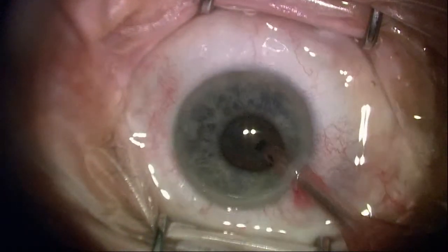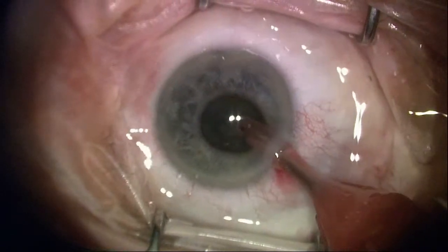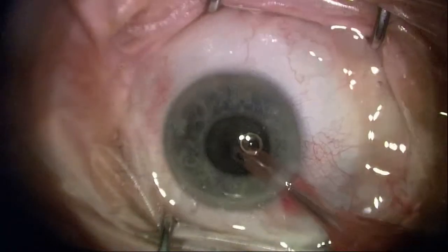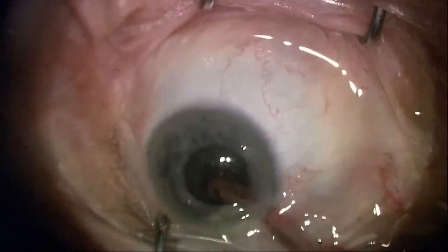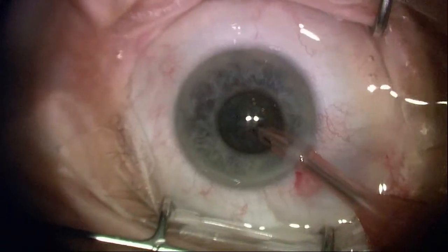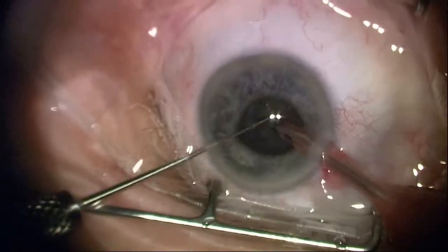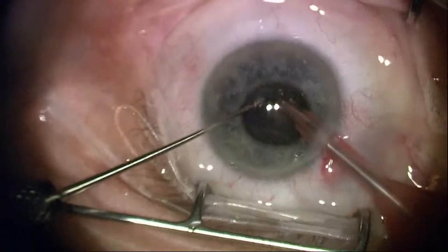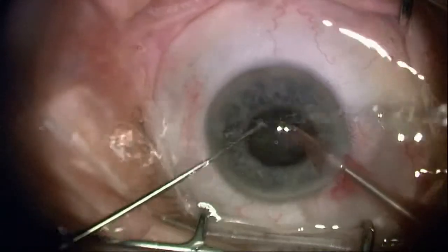I'm going ahead and maximizing occlusion. Now I've flipped it over where I've got the port superiorly — a couple of bubbles there — but I'm going to go deep. I don't worry about going long; I want to go deep so that I can come in with a second instrument and do a nice cracking. I've gone through the nucleus, and I'm going to do a second crack here to get a quadrant.